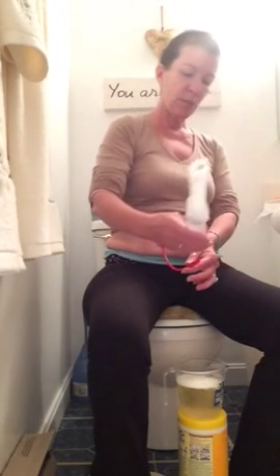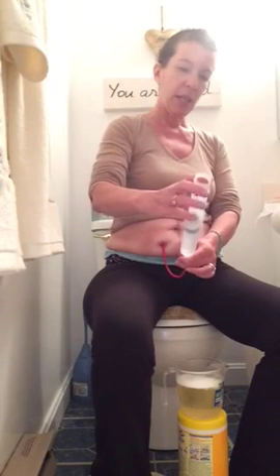All right, so I think I've gone in and out. I've turned a cup a little bit, quarter turns. Those help for some reason. I don't know why. So you can see. Now I'm going to flush. Push it in a little bit. Take my syringe, which has been pre-filled. Push this in. You don't feel any pressure. I feel like a coolness.